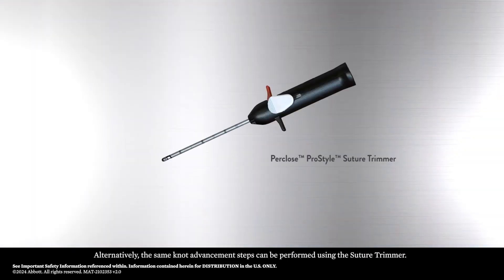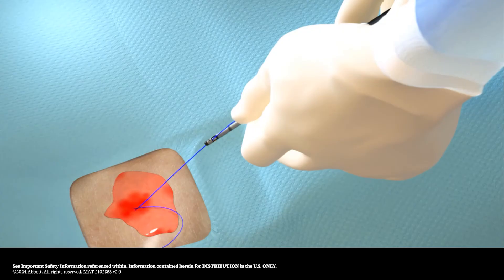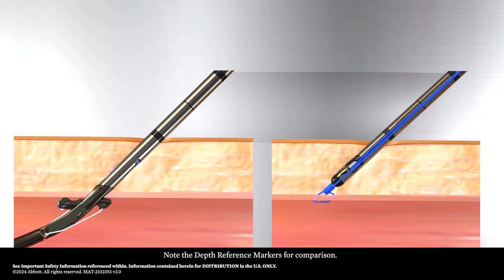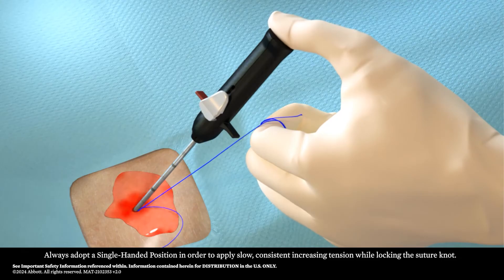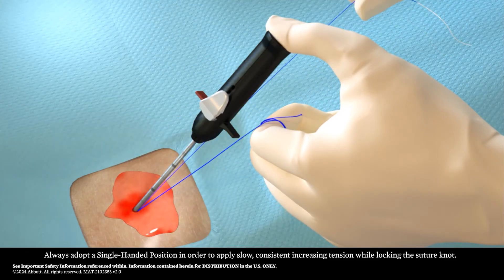Alternatively, the same knot advancement steps can be performed using the suture trimmer. Note the depth reference markers for comparison. Always adopt a single-handed position in order to apply slow, consistent increasing tension while locking the suture knot.